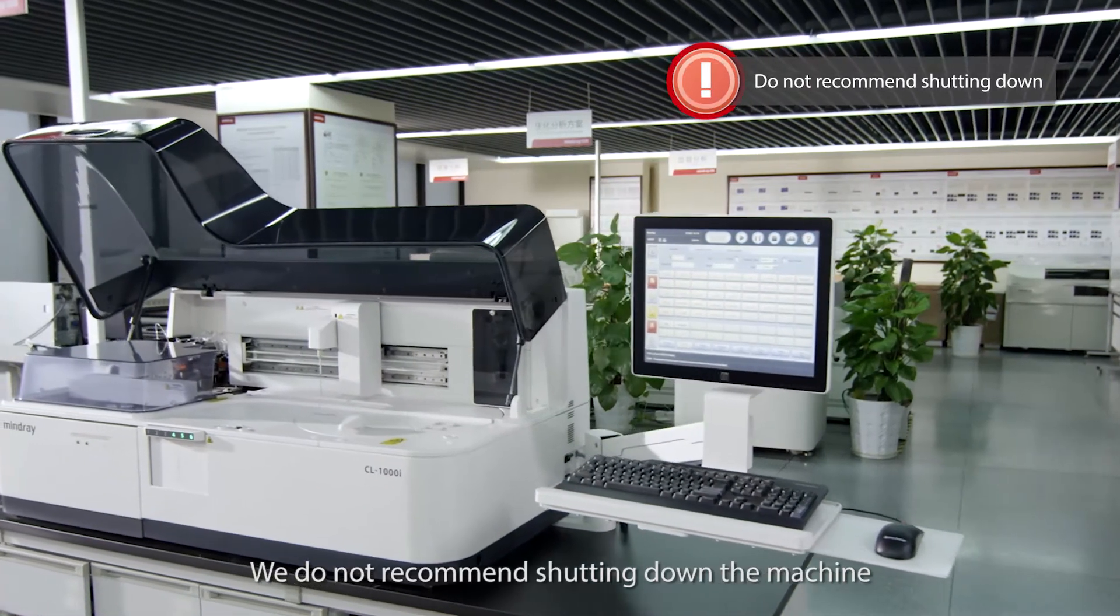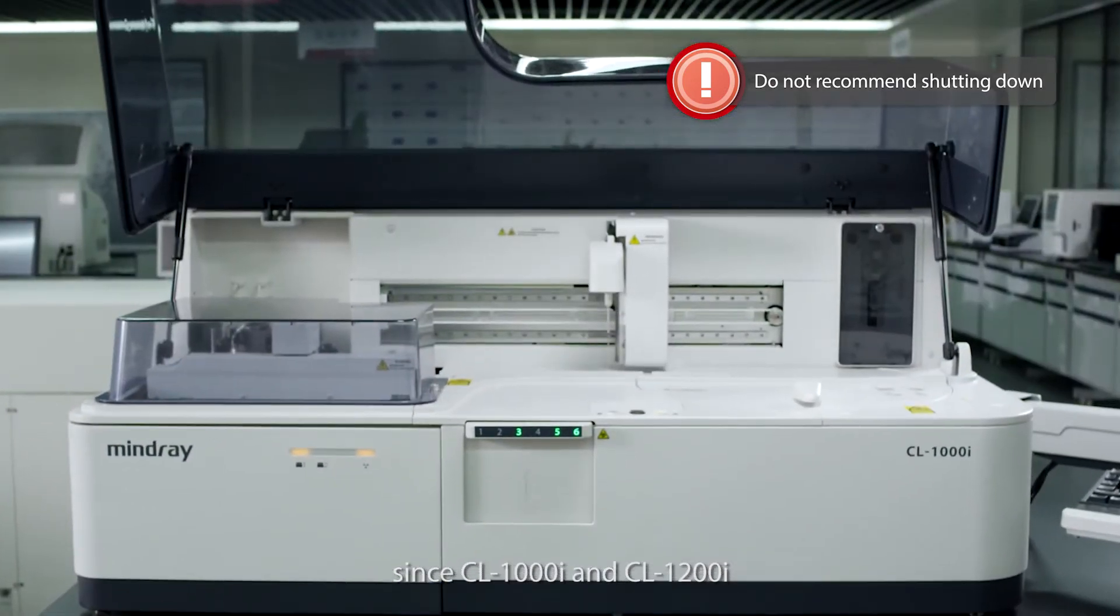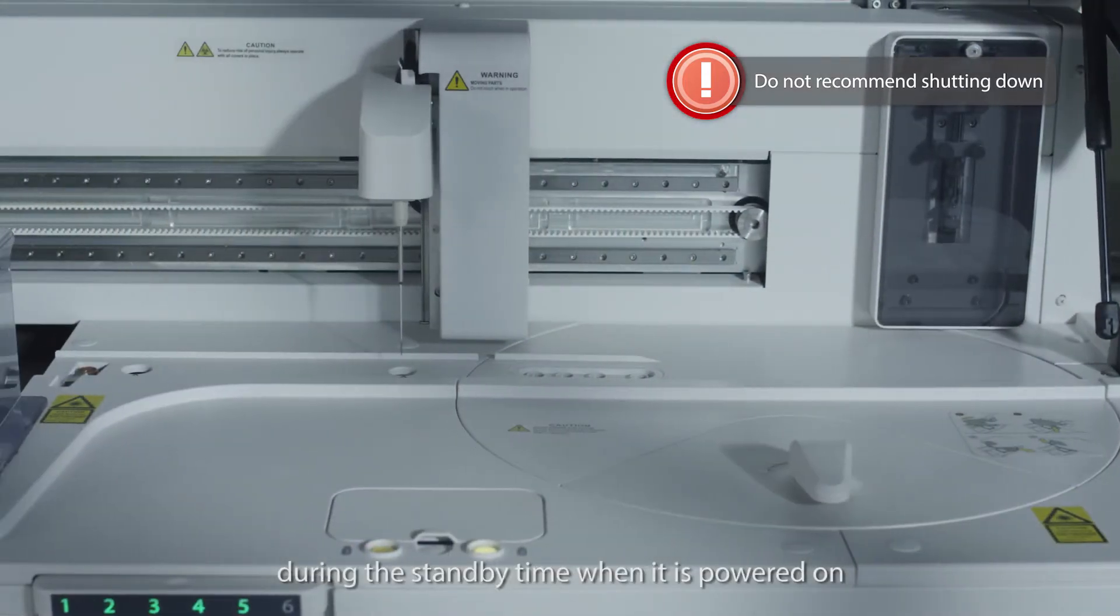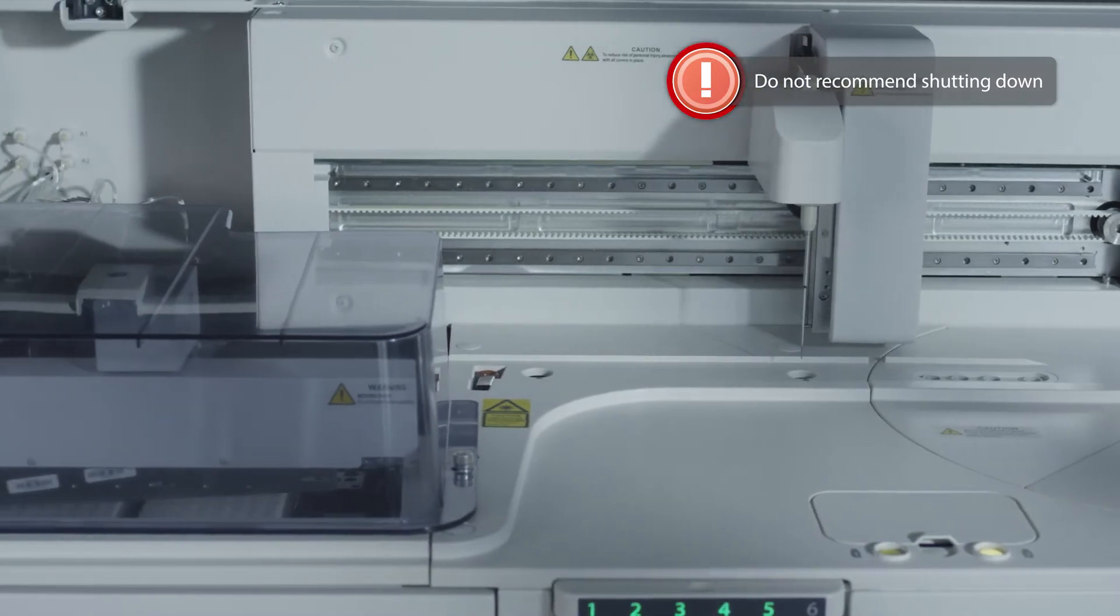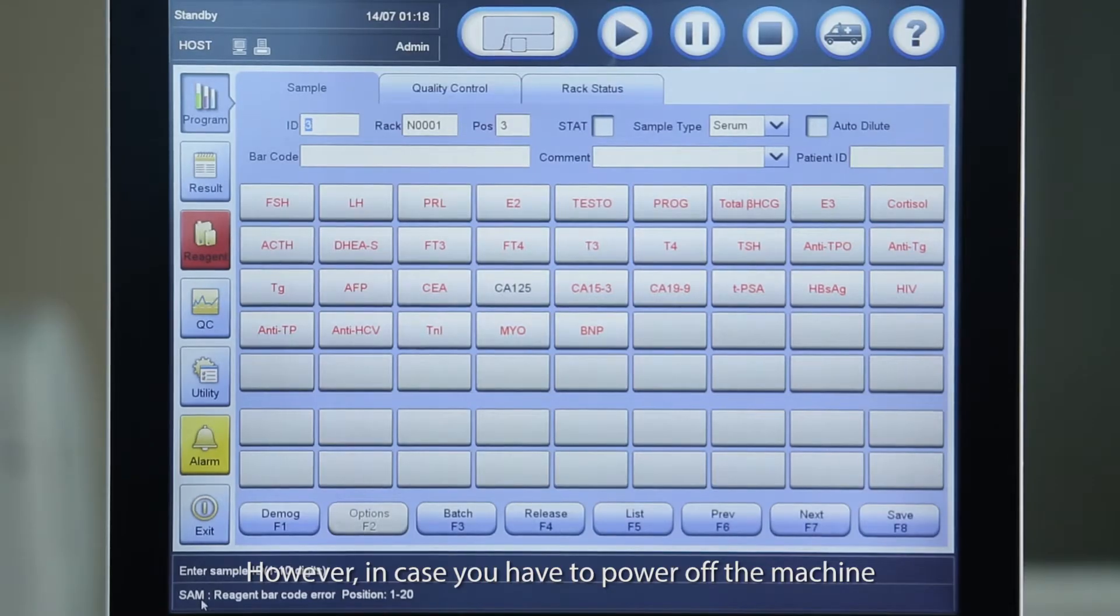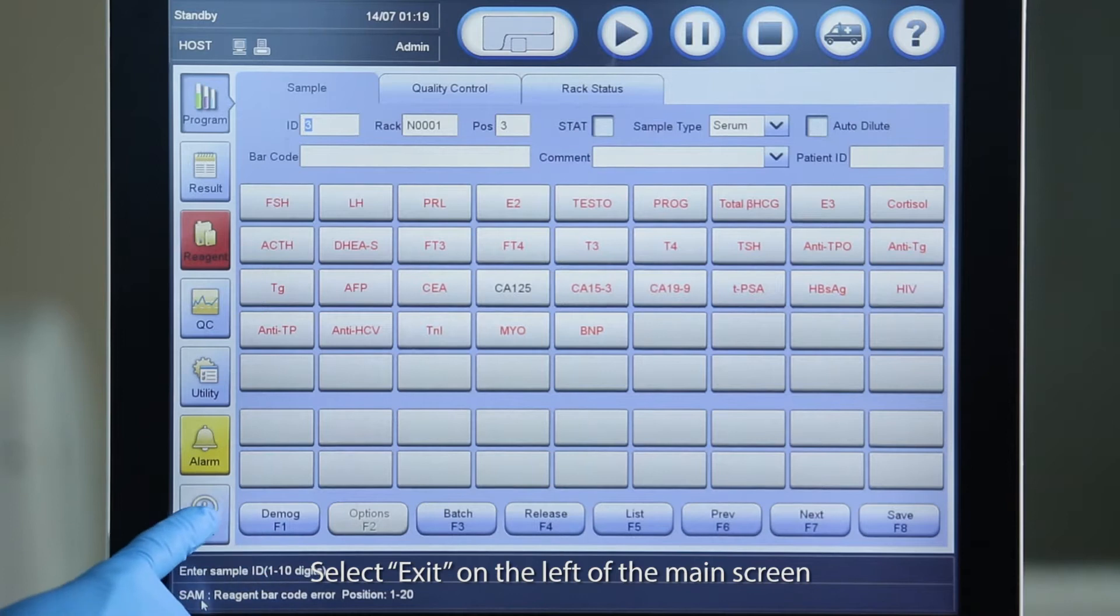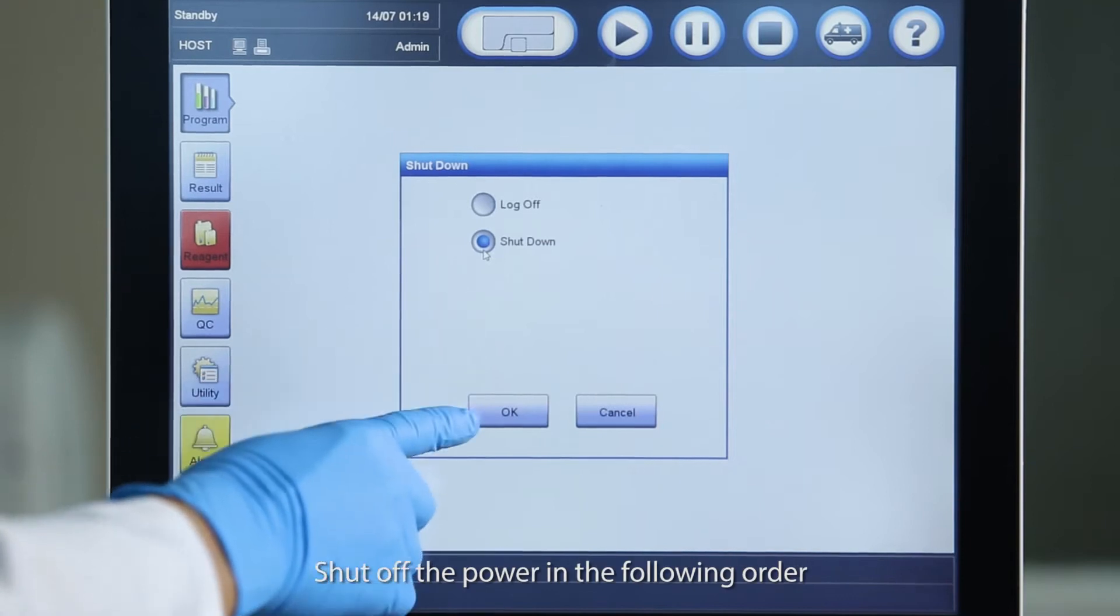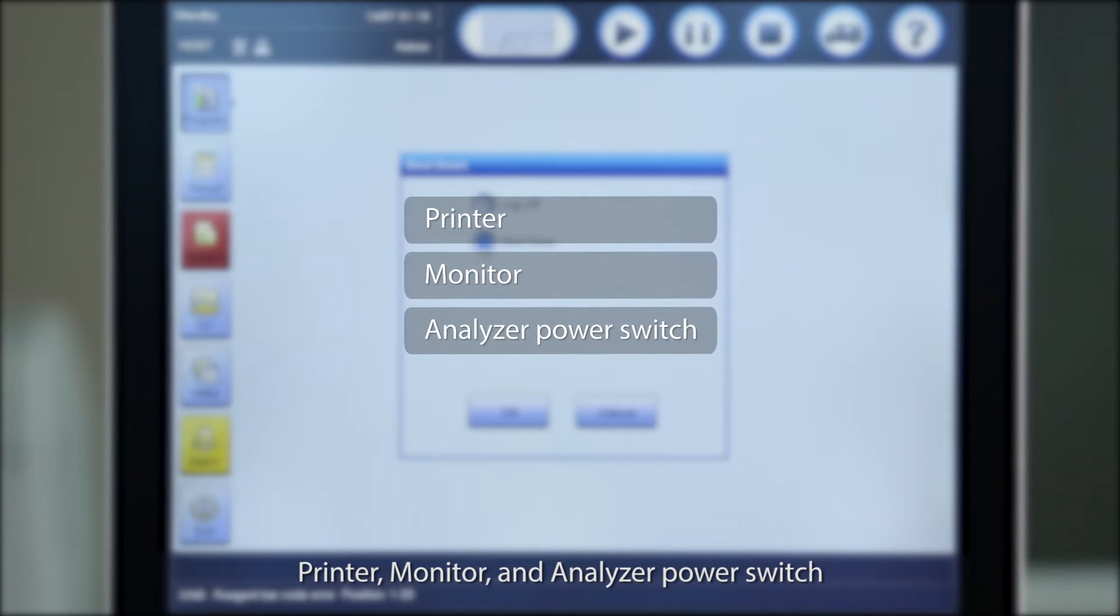We do not recommend shutting down the machine since CL1000i and CL1200i can run cleaning process and system check automatically during the standby time when it is powered on, which can ensure the performance of the system. However, in case you have to power off the machine, please make sure that the system is in standby status. Select exit on the left of the main screen and then select shut down. Shut off the power in the following order: printer, monitor and analyzer power switch.